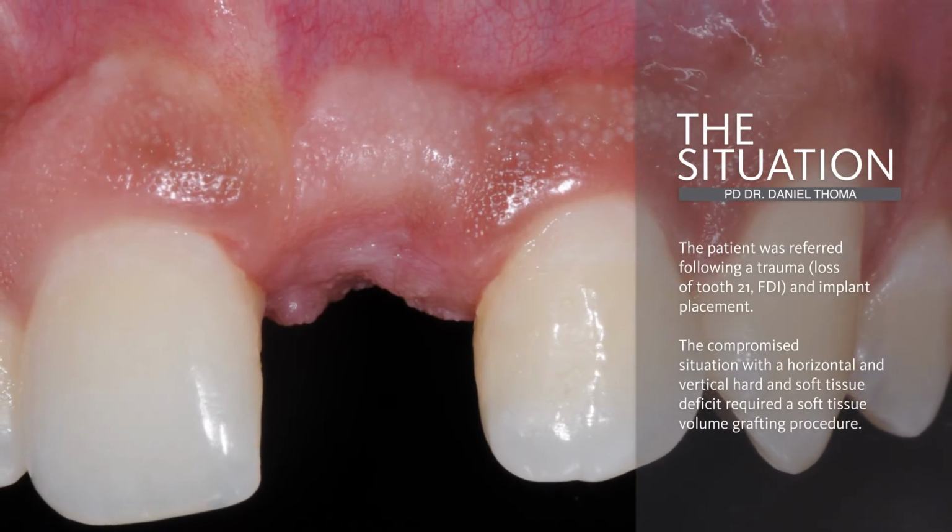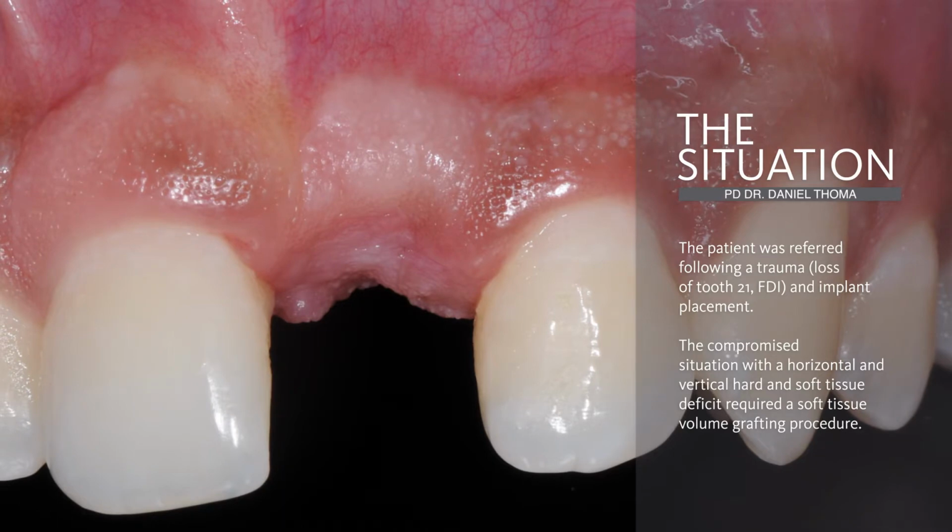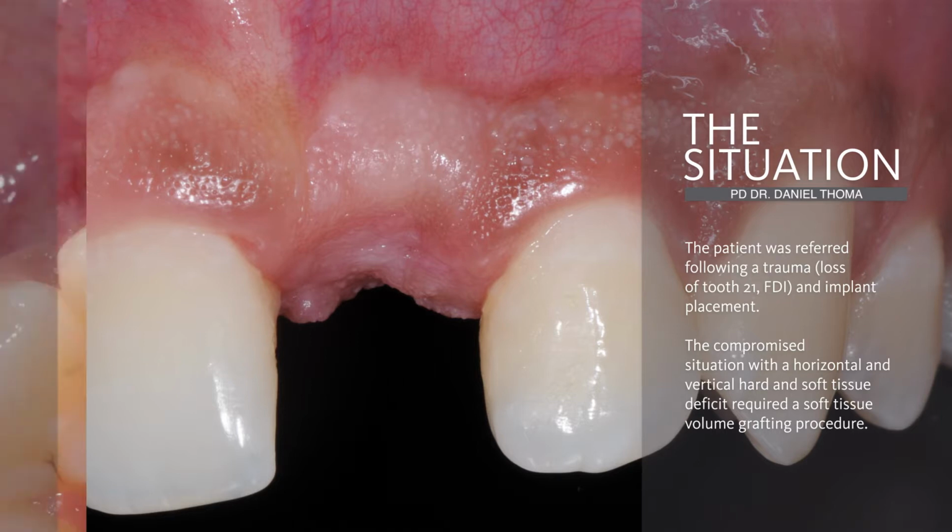The present clinical situation describes a young patient who was referred to the clinic with a missing central incisor 21 and an implant being placed in the respective site. The patient is an Afro-American male who does not smoke and drinks occasionally. Following a trauma on tooth 21, an implant was placed and the patient referred for an implant-borne reconstruction.